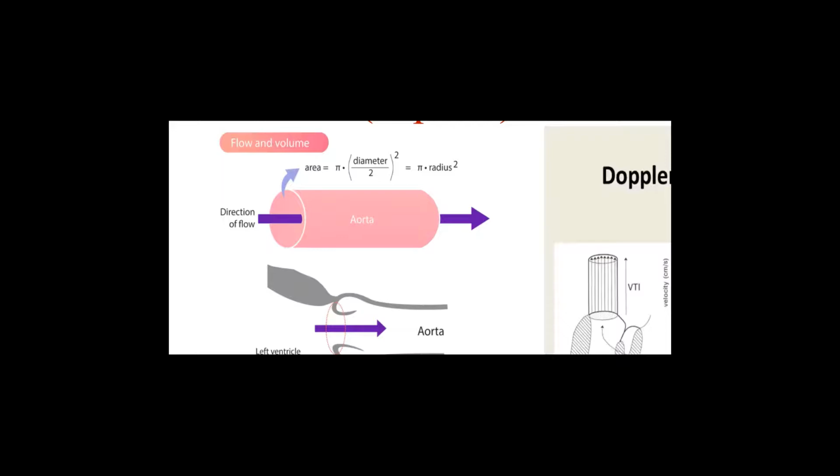Okay, the area, this one, and this one. These are the three dimensions. The area is two dimensions, and this is the third dimension. So I have to get an area and I have to get distance. Now, the area of a circle is what? You remember, pi r squared, right? That's the area of a circle.